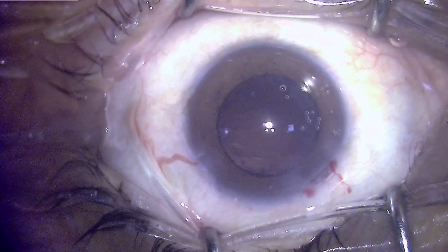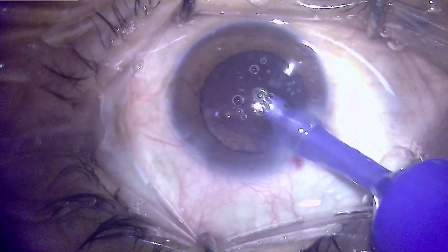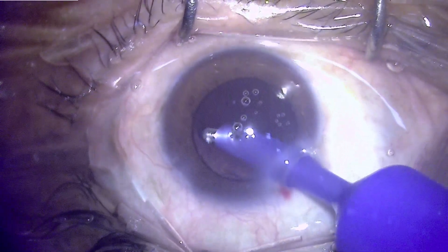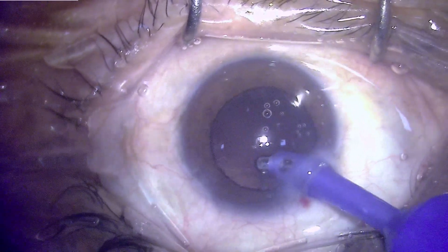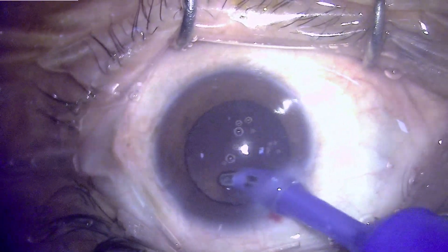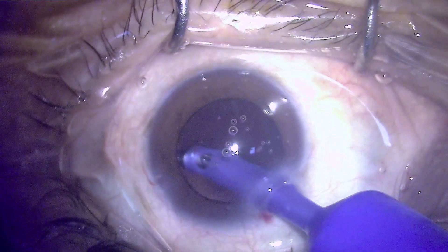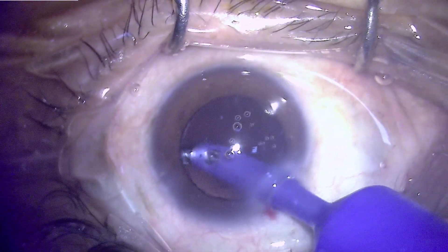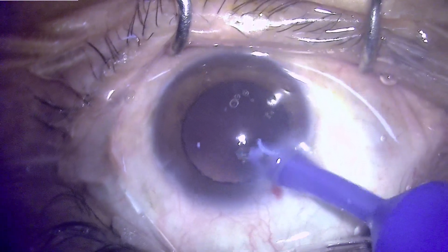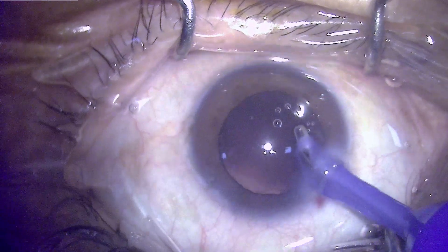Once the surgery has been finished, the remaining cortex can be safely removed using irrigation-aspiration cannula. I encourage viewers to switch to power modulation in whatever machine they have — they will definitely see improvement in the optimum usage of ultrasound energy, which is very important to prevent any collateral damage to the intraocular tissues.